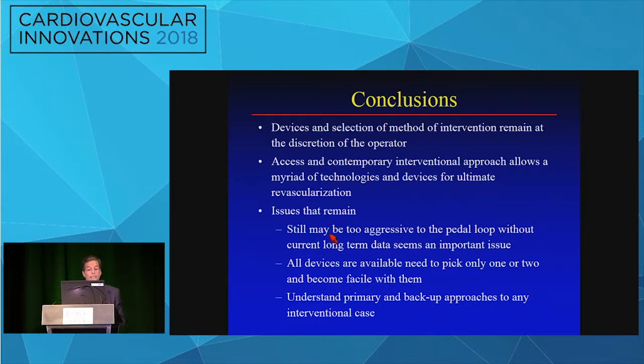And the issue that remains is that we may still be too aggressive in the pedal arch. I really have a hard time believing mucking around down there is going to be good all the time, but if you can get away with it, it works. All devices are available, and you need to pick one or two and become facile with any one of them to actually have a fairly productive and cost-effective program in your hospital. And understand the primary, and then follow it up with your backup approaches when any of those primary approaches fail in any one interventional case.